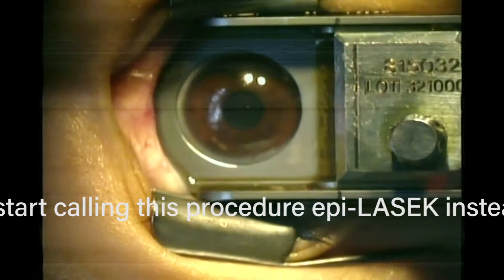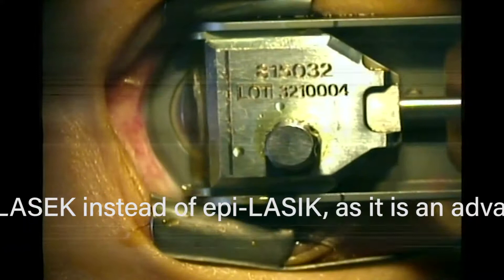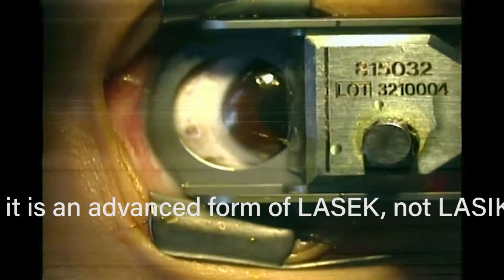This sucks onto your eye. During the procedure, you would feel a little bit of pressure — it doesn't hurt. I had this done myself on a LASIK, which sucks onto the eye harder because it needs to be harder on a LASIK. This is like a plastic separator that's now skidding across the cornea.